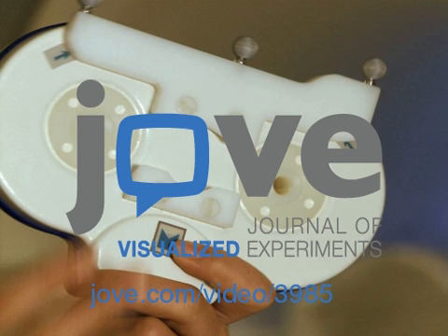Calibrate your subject's head with the stereotaxy tools. Co-register the tip of the nose, the nasion, and the tragus of both ears with the same landmarks on the anatomical data. Two experimenters are needed for this step, one at the participant's head and one at the computer to perform the registration on the computer.